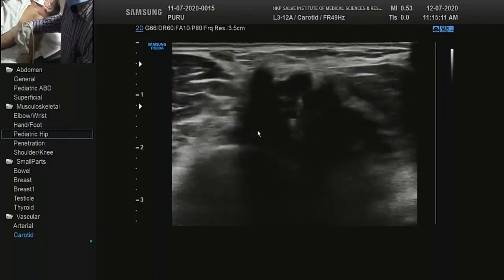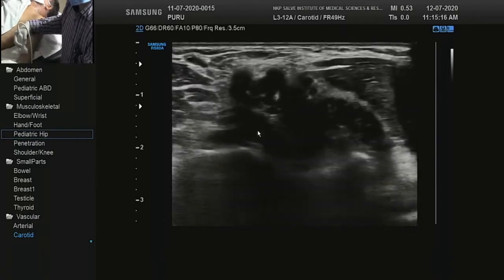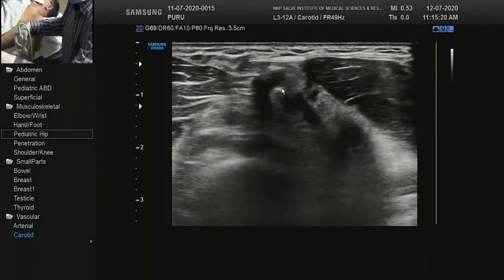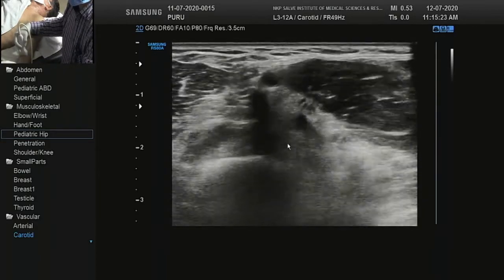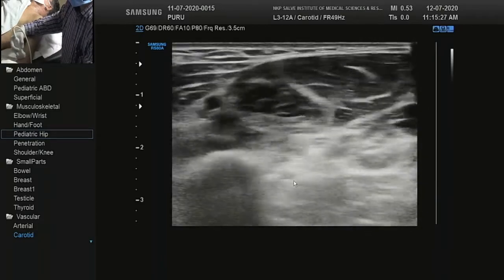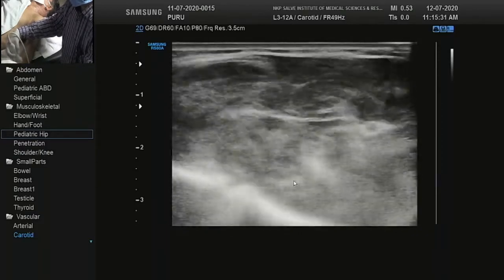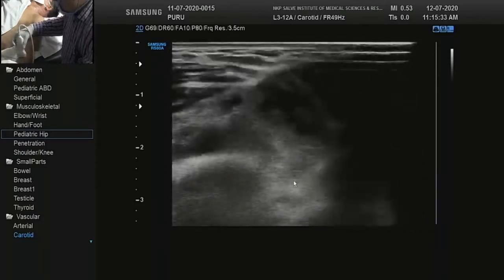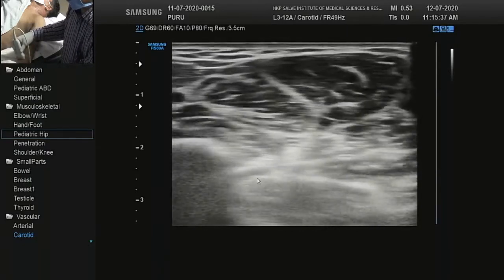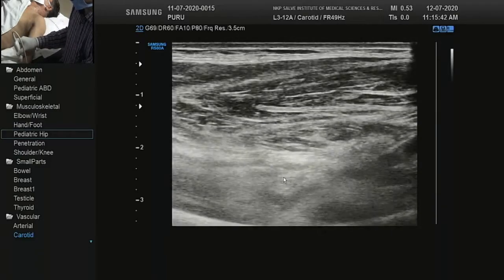Same, we'll try to see the ulnar artery. Go back to brachial, this is the brachial artery, that's the bifurcation, this is the ulnar artery. It goes deep first and then comes out, and we can see it. The ulnar artery is sometimes difficult to see, so if you cannot trace it, see, this is here, from here it will come superficial.